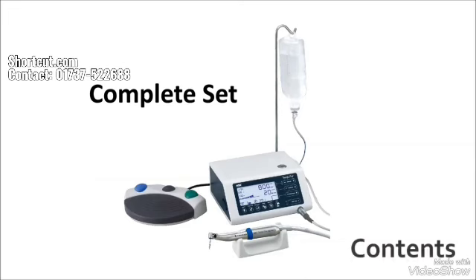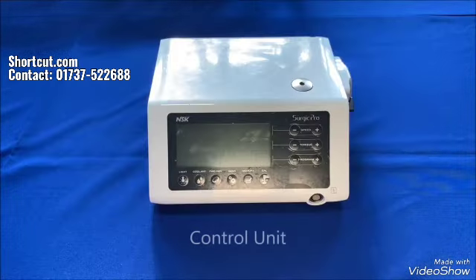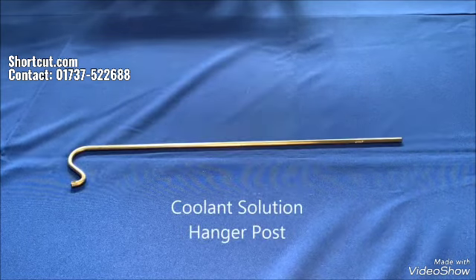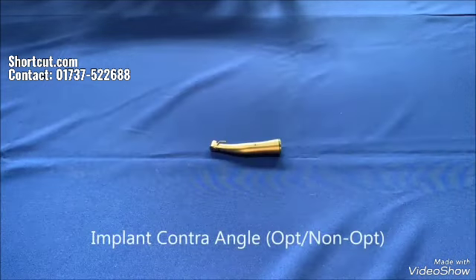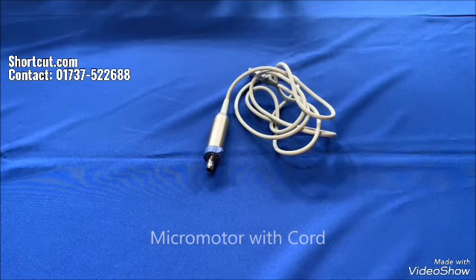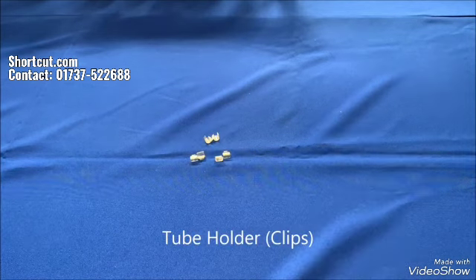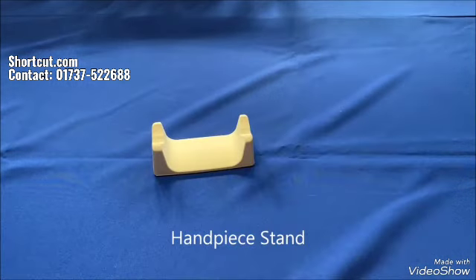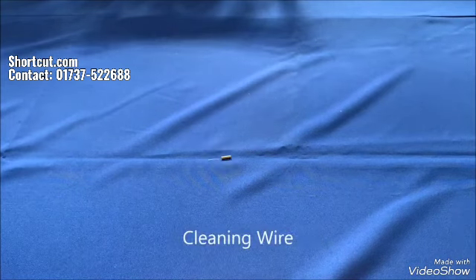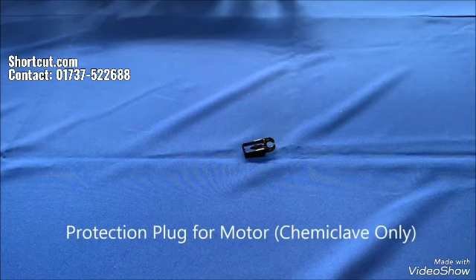The original contents of the package are as follows: AC power cord, foot control with cord, control unit, irrigation tube, coolant solution hanger post, optic or non-optic implant contriangle, micromotor with cord, Y connector, spare fuses, tube holder or clips, handpiece stand, internal spray nozzle, nozzle holder, cleaning wire, calibration drill, E-type spray nozzle, protection plug for motor, and o-rings.